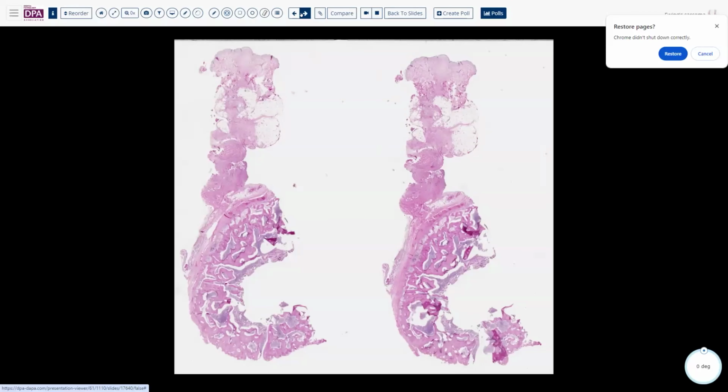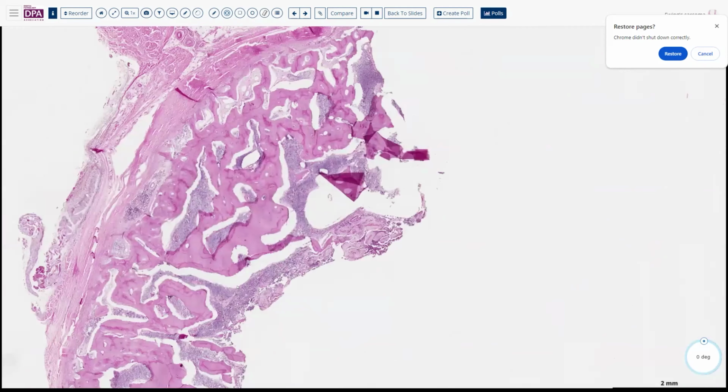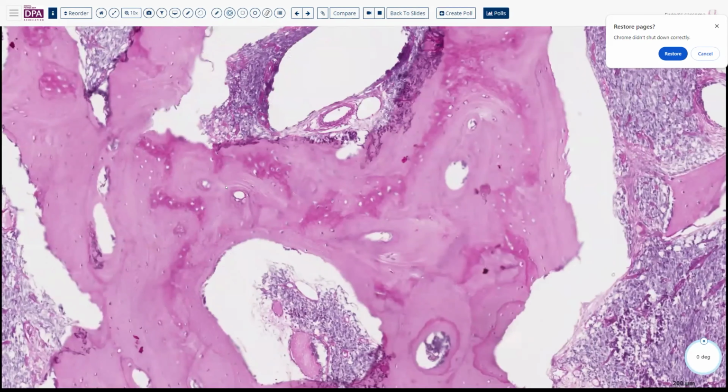Okay, well, let's go a little bit further. This is a specimen that you will probably never see in your experience, because the treatment for this particular disorder has evolved considerably since the time that this sample was retrieved. This is, again, a young child, I believe still in their preteen years. And here again, although there has been some remodeling around these osteons, there's still a lot of primary bone.